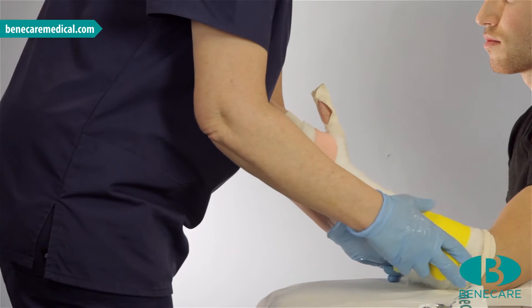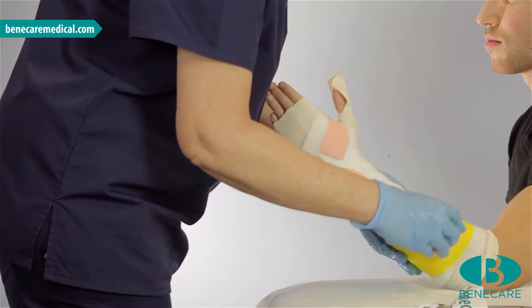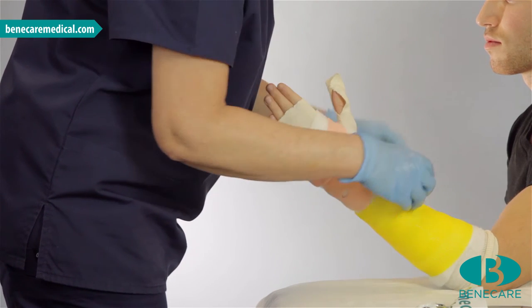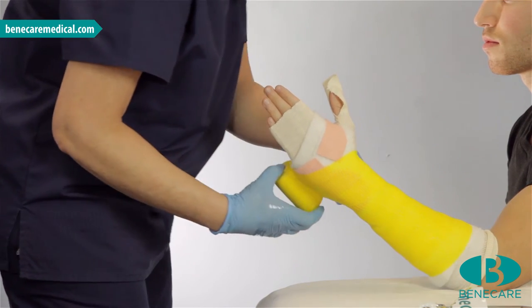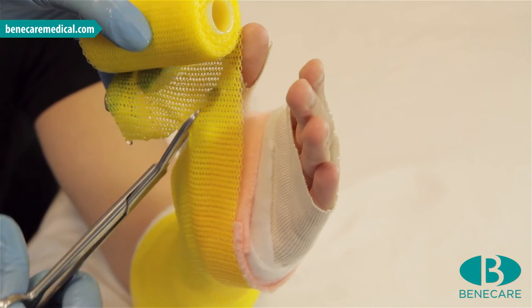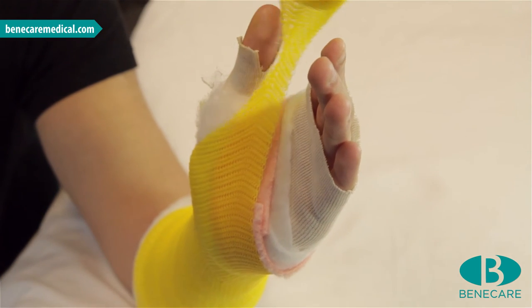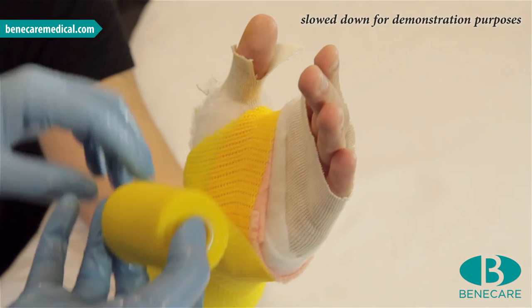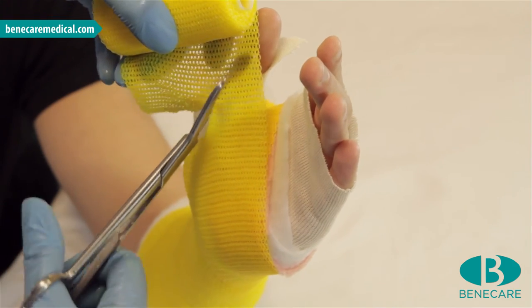I will start at the proximal end, 1cm in front of the edge of the padding. This provides a soft edge, covering the previous turn by 50%. Working from inside out and keeping the roll close to the limb, continue along the arm until you reach the base of the thumb. As the casting material is draped across the palm, cut it following the line of the thenar eminence, leaving approximately 1.5cm to go through the web space. Continue around the dorsum of the hand and across the palm, then make a second cut to go through the web space as before.